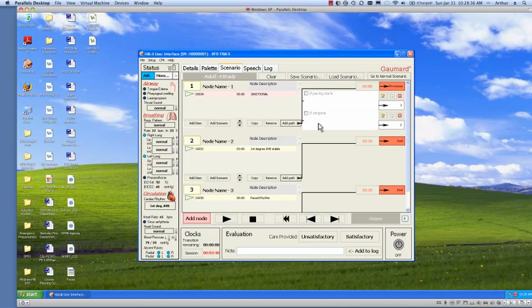So it looks a little bit different, but what's interesting here is, if we go back to that bradycardic patient, this one may be the better one to use, because depending upon if they use atropine to speed up the heart rate or if they start pacing, you can automatically default into an established response. So again, pushing the start button, the play button, will get the node going. And right now it's back to that junctional rhythm again, as we started with before.